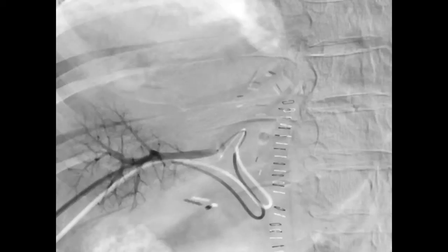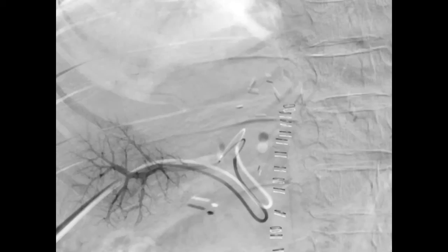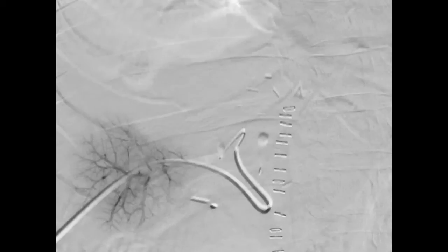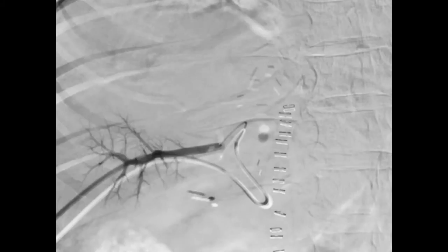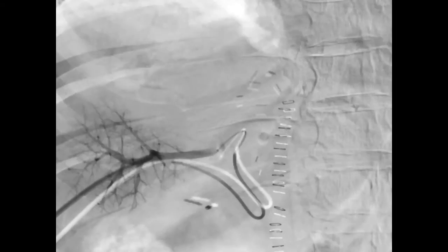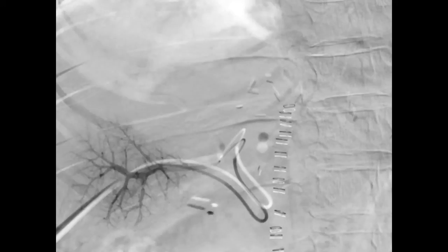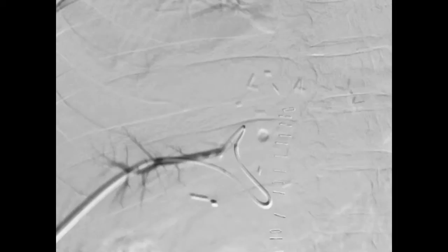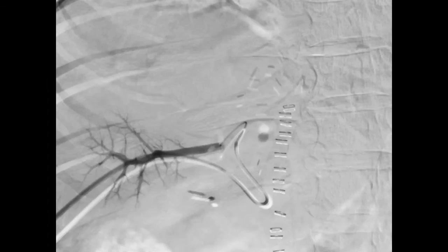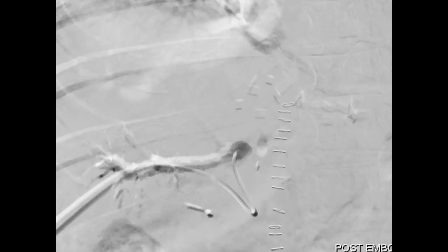Now I introduce my direction microcatheter together with a 014 guide wire. In this case I take the large lumen high flow version. First because it enables me to inject a high amount of contrast media with high pressure to get very good quality imaging. Then because I will inject my Glubran mixed with lipiodol. Here you can see on the super selective portogram through the direction that it is in the right position to start embolization of this portal vein branch.